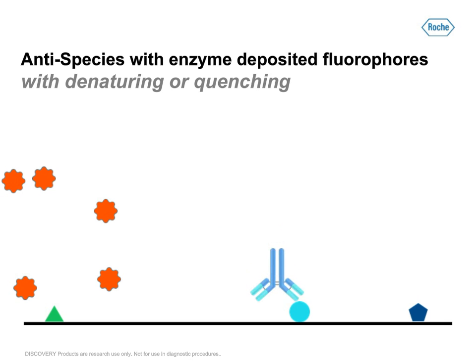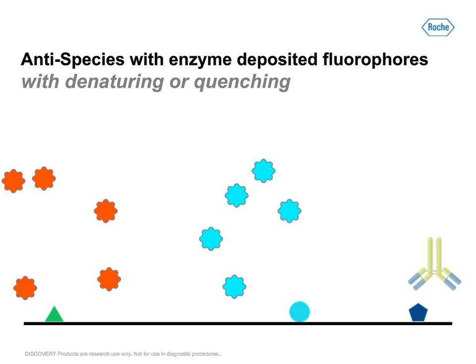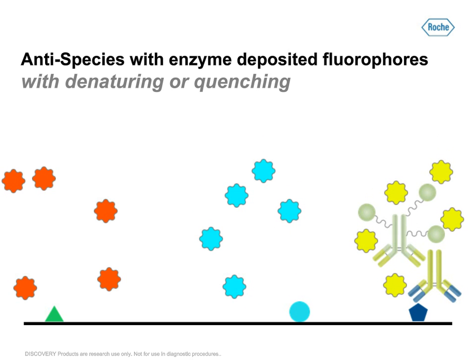And then you come in with your second detection, and then you do an elution step again, and then your third antibody with that elution as well, and that turns over the same. Therefore, what is turning over is essentially depositing where it should be.